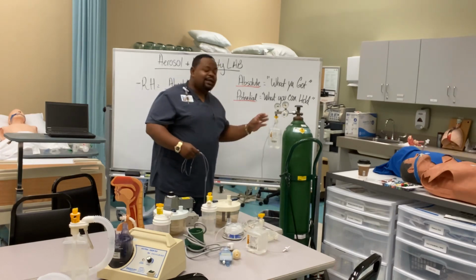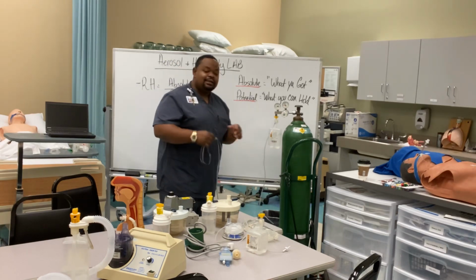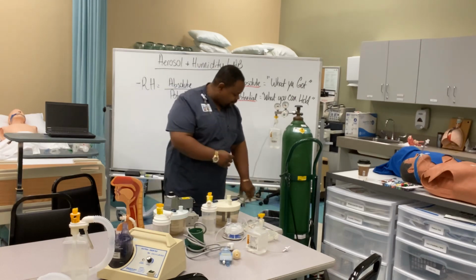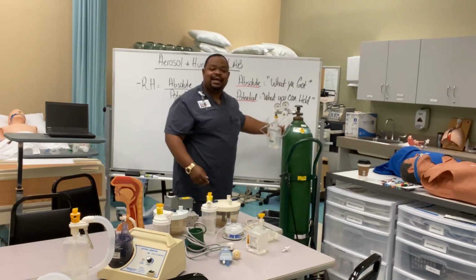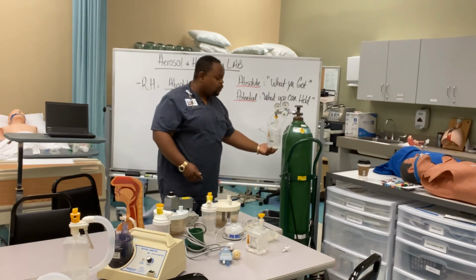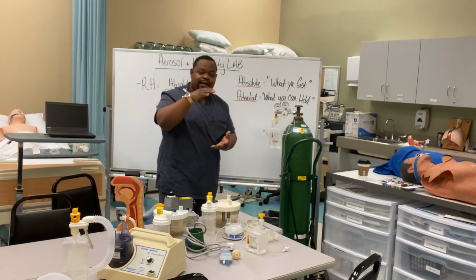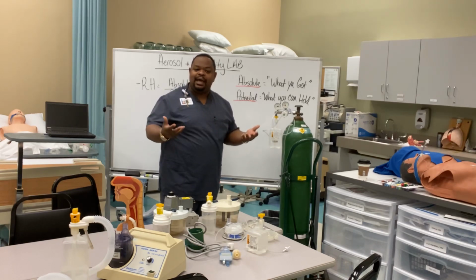So the concept, or what happens for the humidification, is contact time, right, and particle size, right? So we want a longer contact time. So the longer that the water or the bubbles are interacting with the water, so the bigger the receptacle, the bigger the reservoir, the more humidity you will have, right?